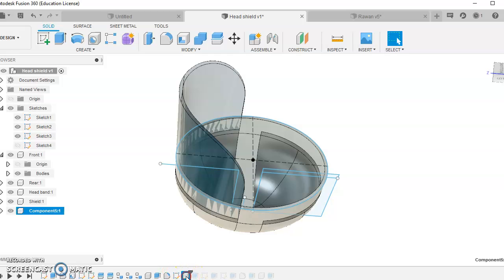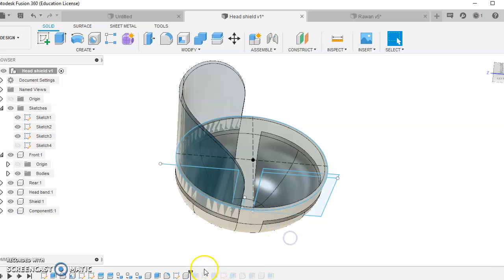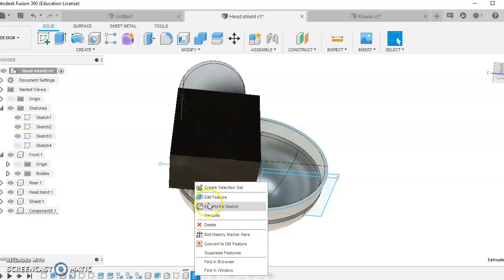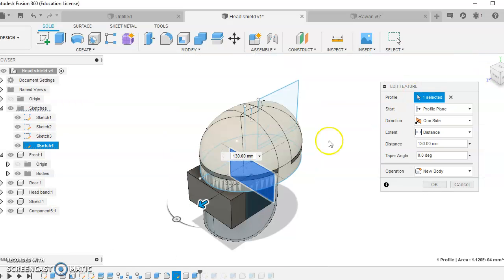If you look at this one, I've deleted part of the screen to make the window. As we move on, now this is the interesting part. When I edit feature here, let me just show you in this view. Now this rectangle is going to come out as a solid block. That's going to be the case for now. We can trim that off later.